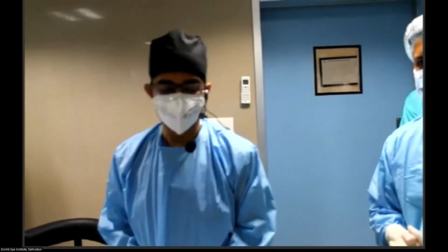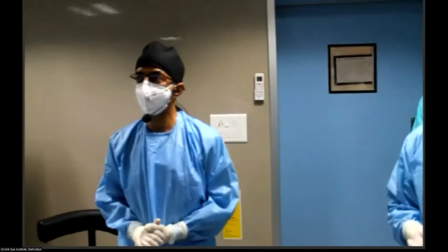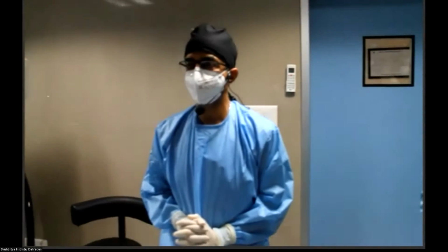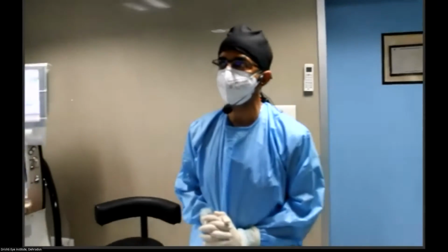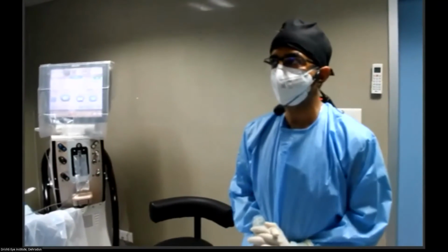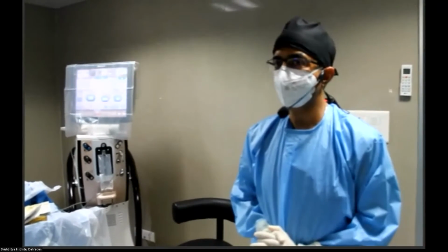Yeah. So thanks to Dr. Malay and Dr. Ruchika and Team KOS for this opportunity. And I'll be showing a couple of intravitreal injections. One of them intravitreal aflibercept and the other one an intravitreal Ozurdex implant. And nowadays these injections and implants are the bread and butter of the retina surgeon for a medical retina practice.